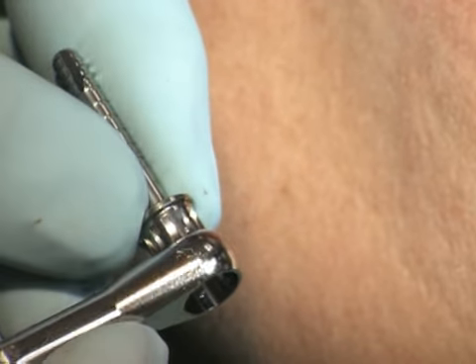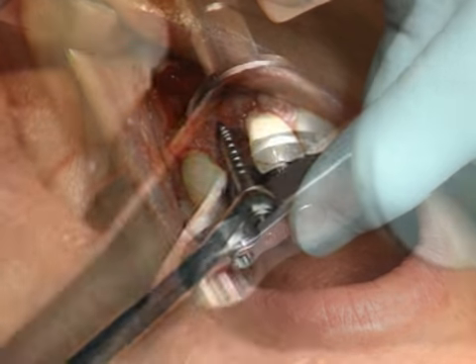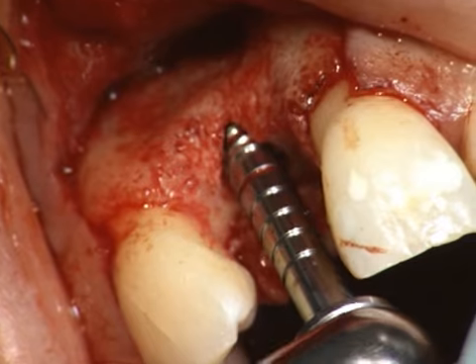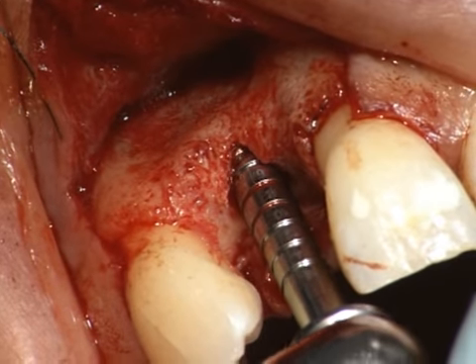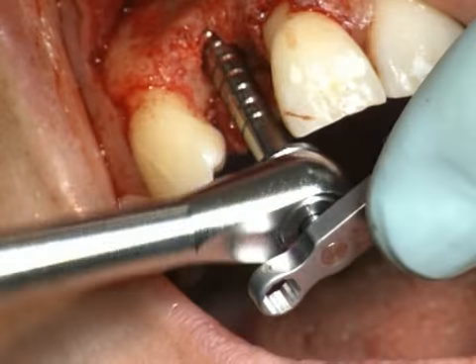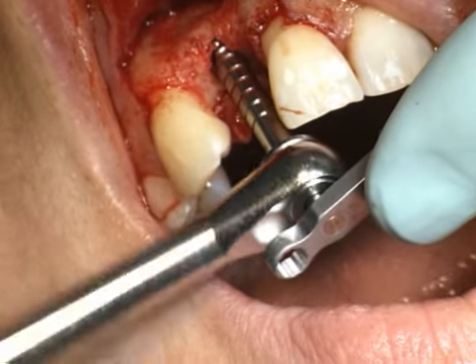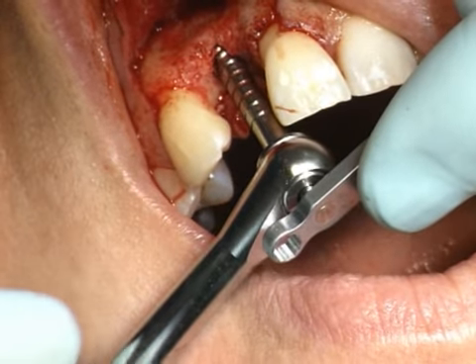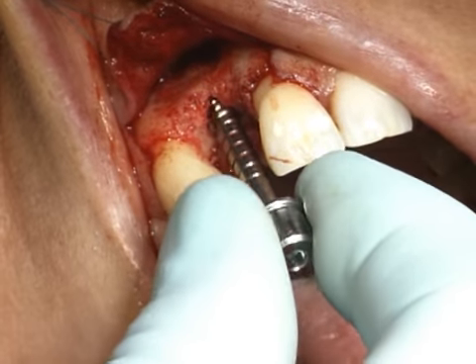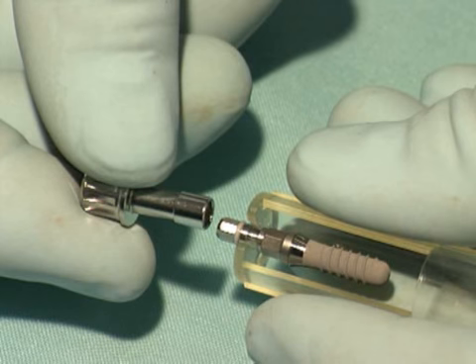To do this, the looped end of the ratchet is placed over the handle of the tap and stabilized with the holding key. The arrow on the ratchet must point in the clockwise direction. When the desired depth is reached, the arrow on the ratchet is changed to counterclockwise and the tap is unscrewed from the implant bed. In this case, use of a StandardPlus implant with an endosteal diameter of 4.1 mm and a regular neck of 4.8 mm is planned.